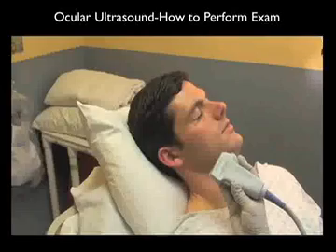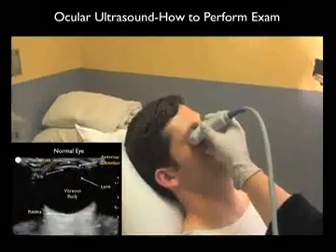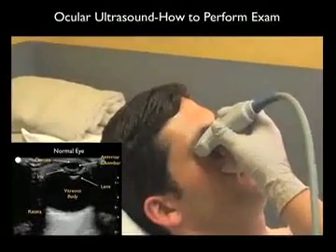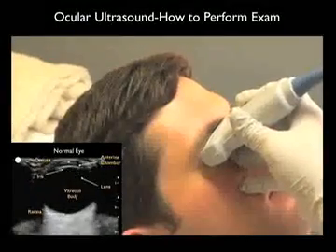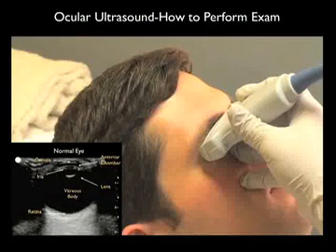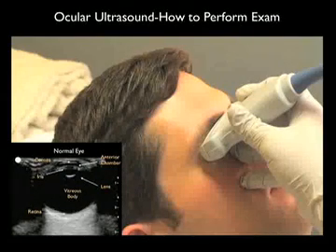Here we have the high-frequency linear array probe in hand, and note we've prepared our patient with a copious amount of surgery lube on the outer part of the closed eyelid. We're going to gently place the probe over the patient's closed eyelid, scanning through the eye. Note that we're going to orient the probe both superior and inferior, looking all the way through the eye from the anterior aspect down through the posterior part. I like to have the probe marker oriented laterally towards the outer part of the patient's face so that I know where the structures of the posterior part of the eye are oriented.